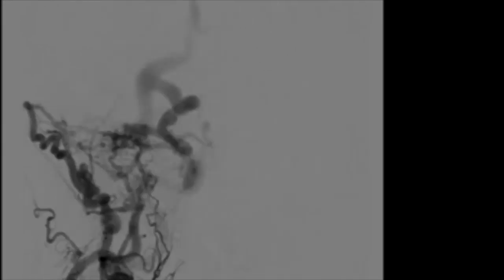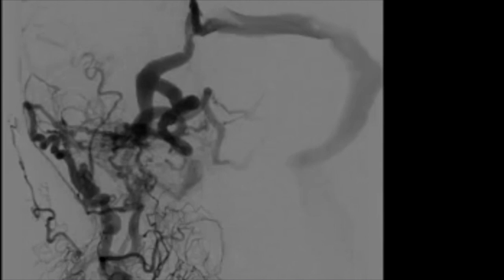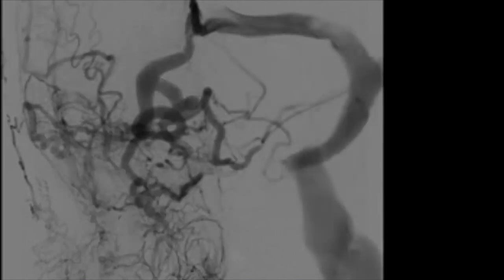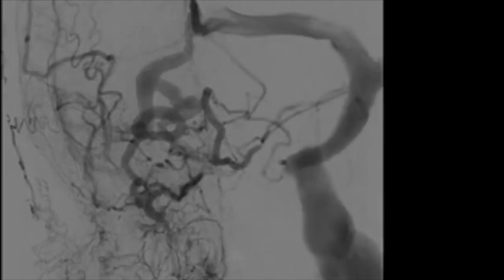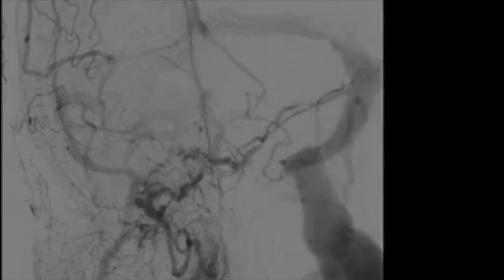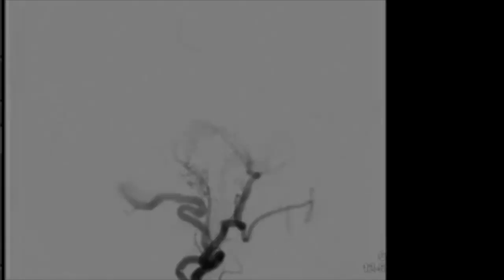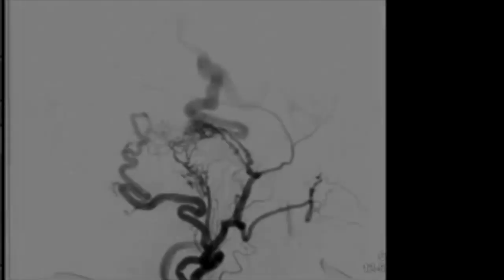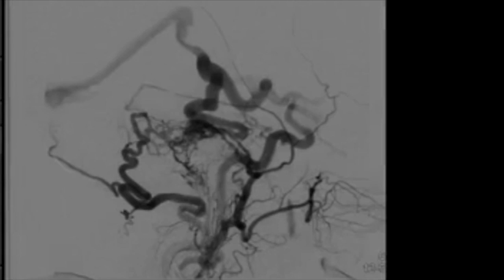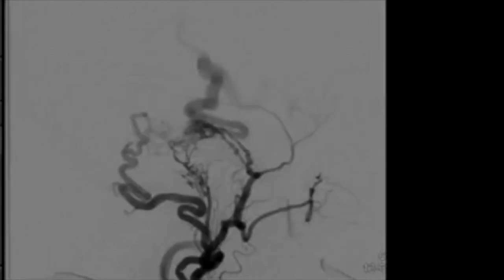This angiogram demonstrates the complexity of the fistula with multiple feeders coming from the occipital and middle meningeal arteries. In the lateral view, you can observe better the multiple branches of the occipital artery and middle meningeal artery, and a very large tortuous draining vein into the vein of Rosenthal.